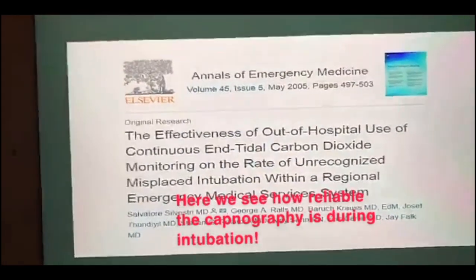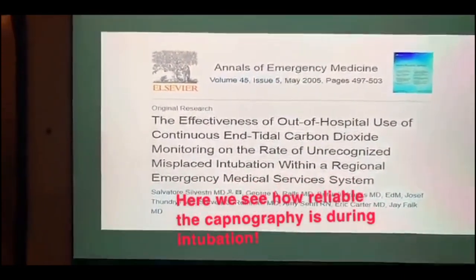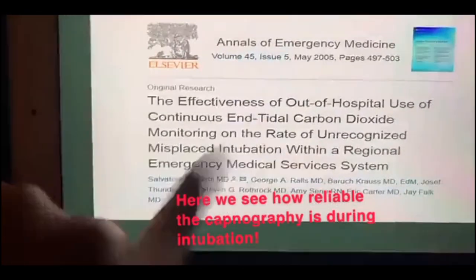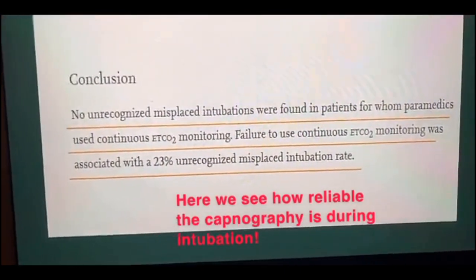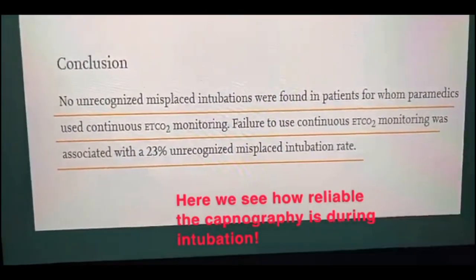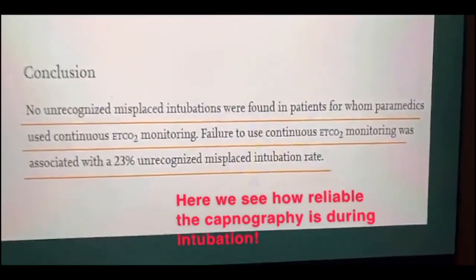One of them uses end-tidal CO2 during intubation and the other doesn't, and they look at the percentage of unrecognized misplaced intubation in those groups. The conclusion was that no unrecognized misplaced intubation was found in patients for whom paramedics used continuous end-tidal CO2 monitoring, and failure to use end-tidal CO2 monitoring was associated with a 23% unrecognized misplaced intubation rate.